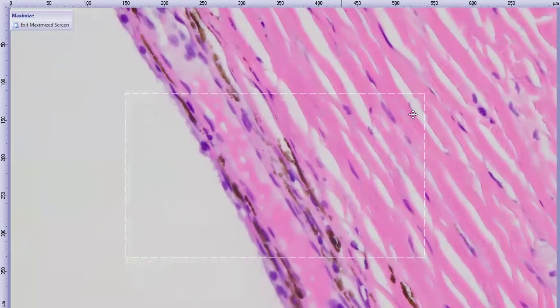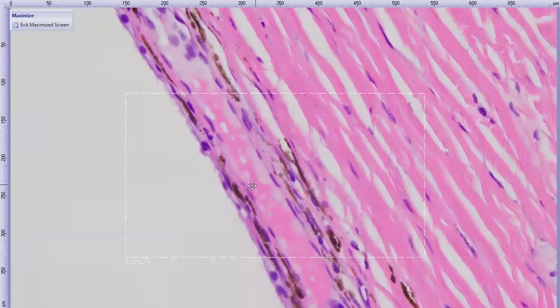We can see that there is a layer of retinal pigment epithelial cells here that is non-pigmented. This is the dorsal fundus or the dorsal choroid. We don't really see much of a tapetum, but sometimes it can be quite thin in dogs. The choroid stroma at this level also has a few stromal melanocytes, spindle-shaped cells that are laden with melanin. So it's a brown choroid. Keep that in mind.